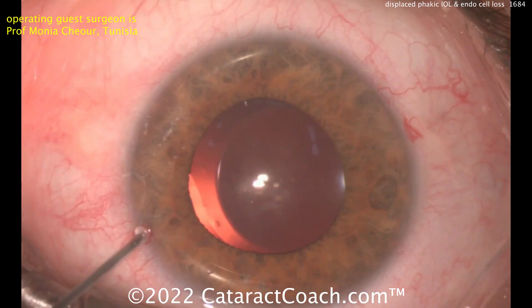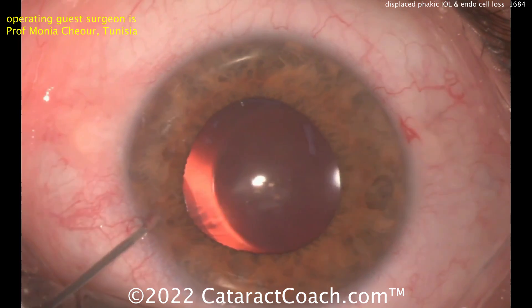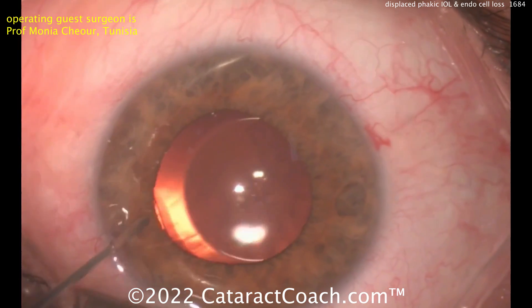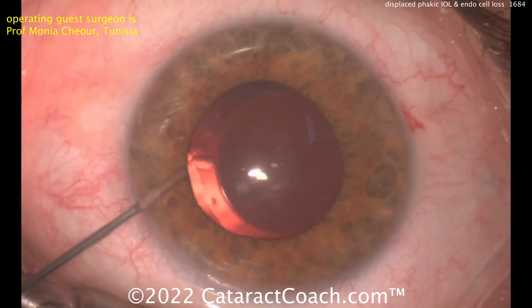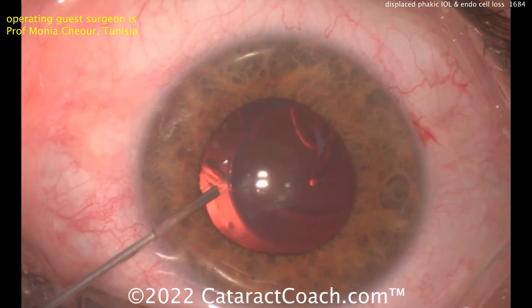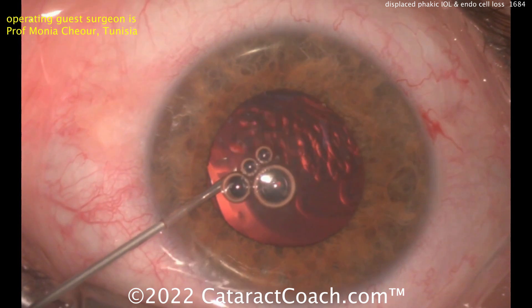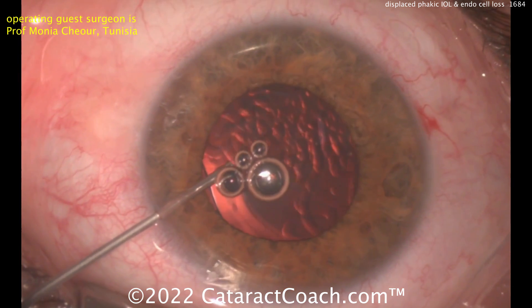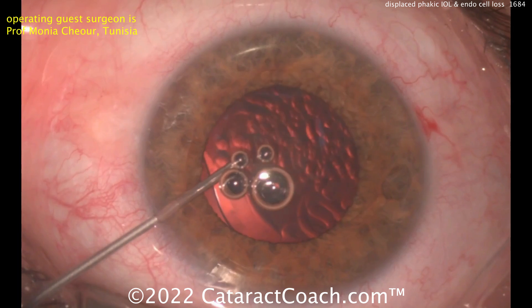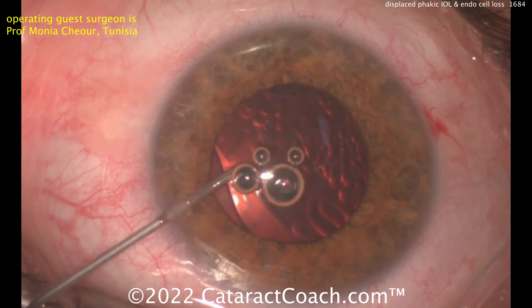This is why the surgeon is going to elect to remove the lens and actually make the patient pseudophakic. This phakic eye is certainly causing endothelial cell loss — maybe it's because of the positioning of it, because the other eye doesn't have any issues.